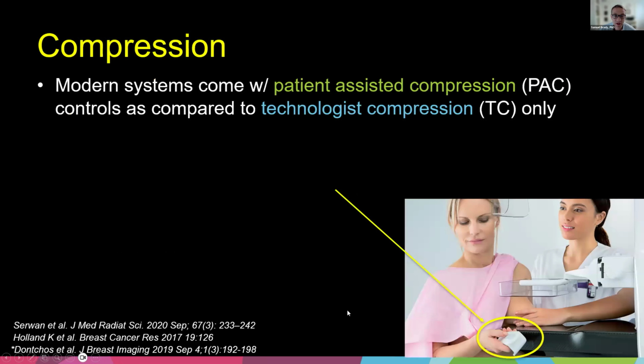More recently, there have been several developments to help provide more consistent compression. And this comes in the form of something called patient-assisted compression, or PAC, compared to when the technologist does all the compression themselves.